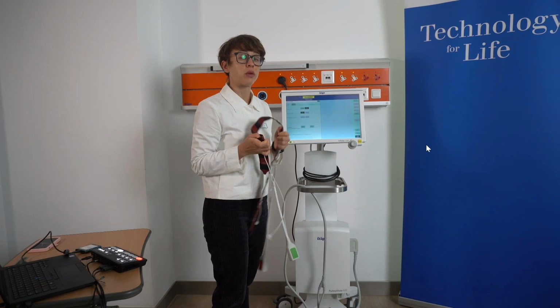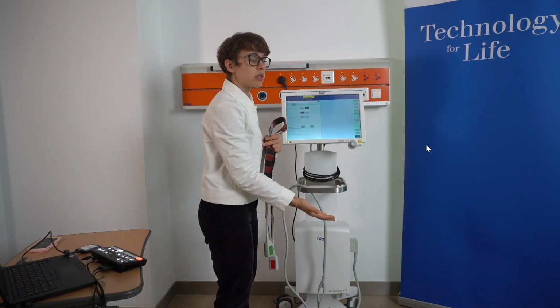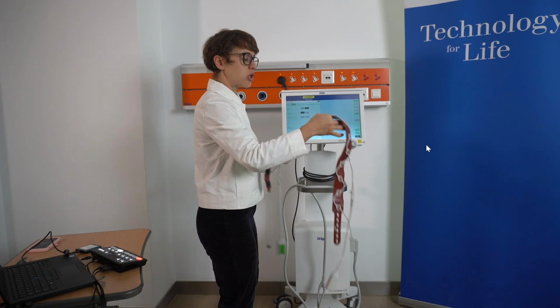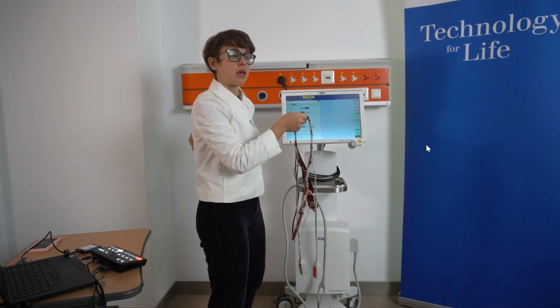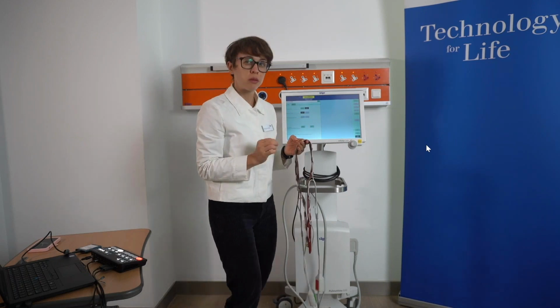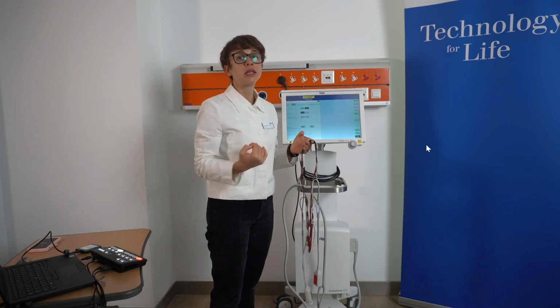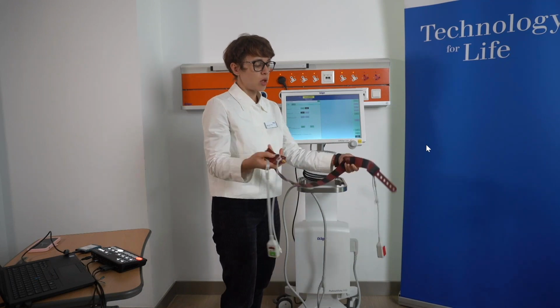So there are two ways you can place the belt. One way is you can lift your patient, keep your thumb on this midline position, and slide the belt back onto the patient. For male patients we position it around the nipple area, and for female patients it is usually done under the breast. Once the belt is positioned, you just close the belt.